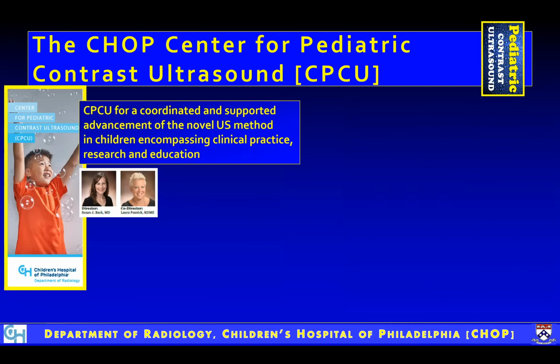Just for you to understand the off-label applications that I'm presenting is in the background that at the Children's Hospital of Philadelphia, we have the Center for Pediatric Contrast Ultrasound. And this was established a few years back to coordinate and support all the advancement of contrast ultrasound in all aspects, and is directed jointly by a pediatric radiologist and also a pediatric sonographer.